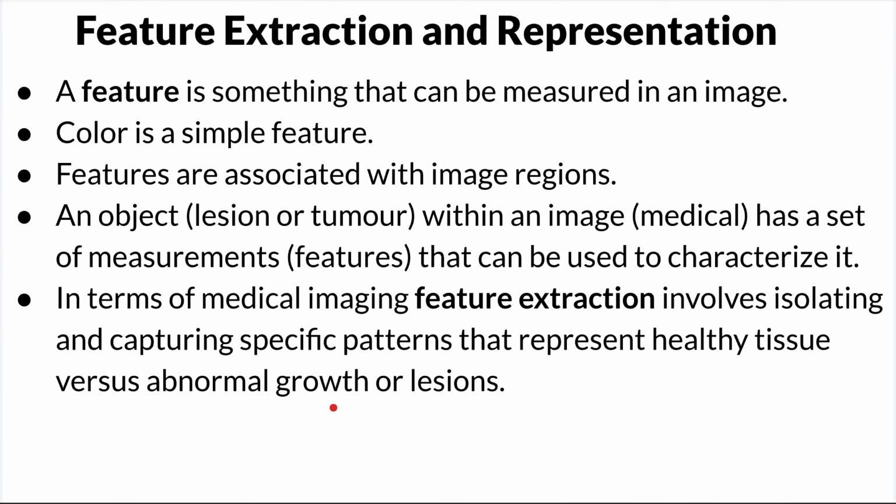All right. Now let's talk about feature extraction and representation. Yesterday I made mention of feature engineering. Now we want to understand what a feature is, right? I told you that features are also known as measurements, something that you measure. So a feature is something that can be measured in an image. Color is a simple feature, right?